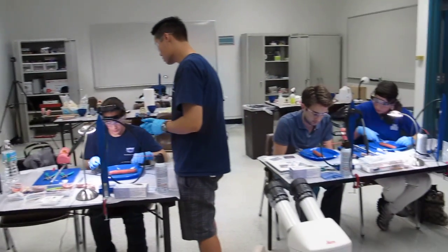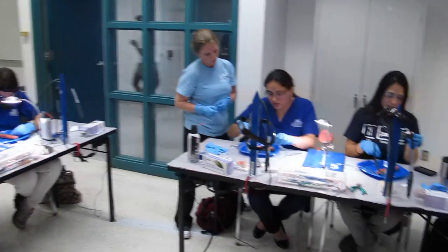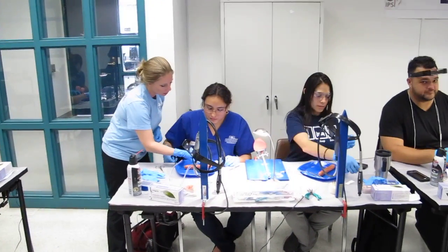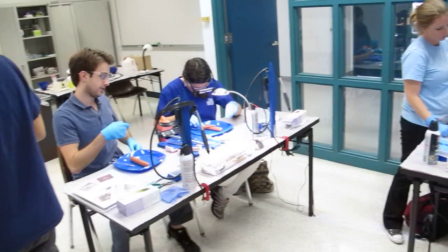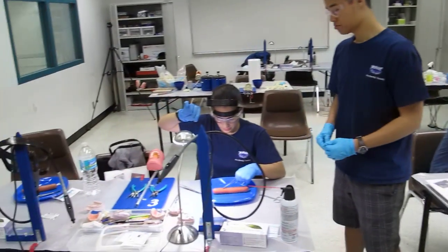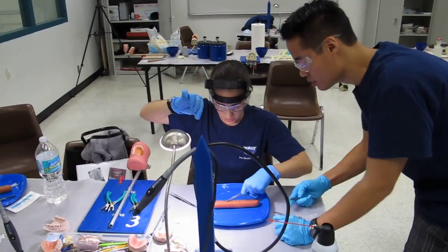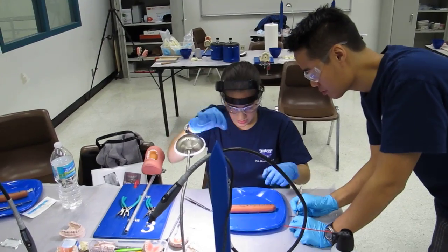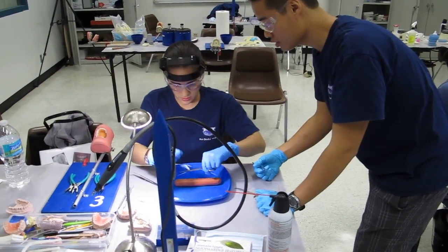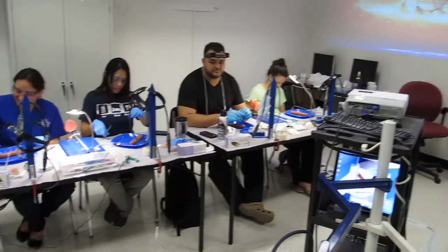But when you come through — we're vertical — we're going to go through. Yeah, the vertical mattress is going to go through. You're going to feed it, you're going to feed it, you're going to go through. That's it, and then it goes — we're going to modify — the trick about this is horizontal. And then do the same method, yes exactly, either way it works, as long as you do opposite. Yes. Okay. Very good.